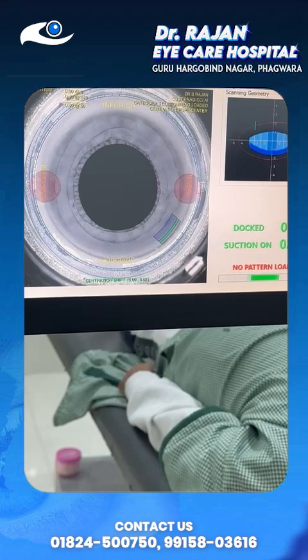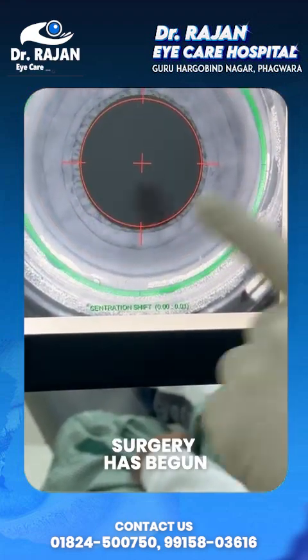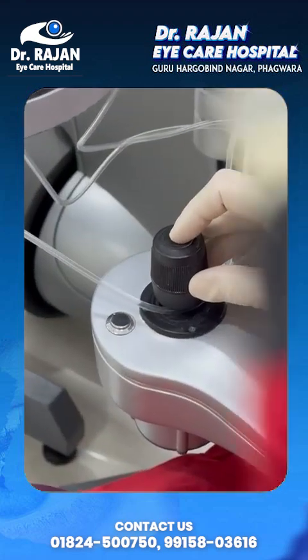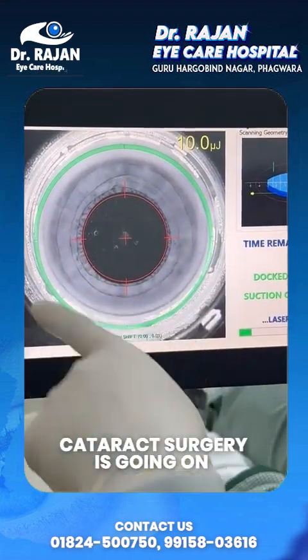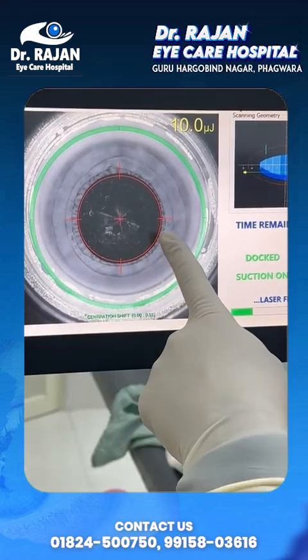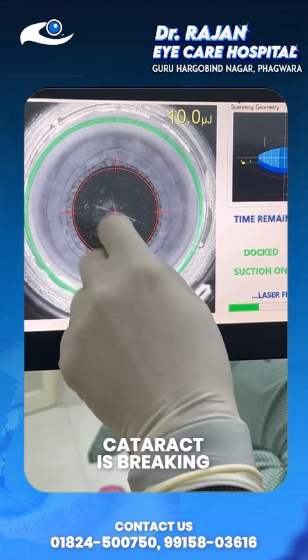Now the surgery begins — just with a click you can see the laser is going to fire and the cataract surgery is going on. You can see these are the fragments of the cataract; the cataract is breaking into fragments.